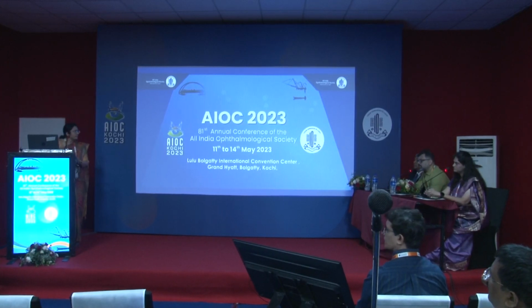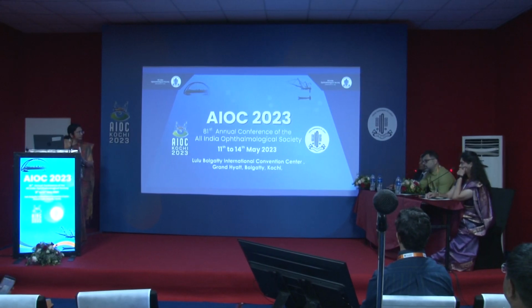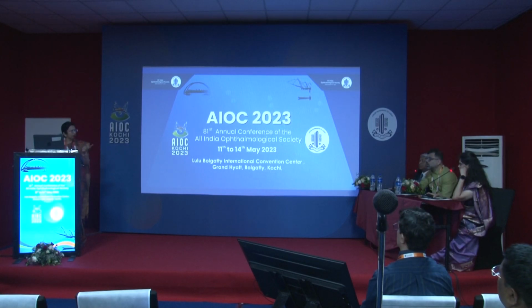Yeah, it's free. As per the latest literature which I read, I think Kane and Barrett 2 are more or less equivalent. Kane used to be better with keratoconic eyes, and now the Barrett TrueK is giving the same results as the Kane for keratoconus as well. Either is good. Barrett TrueK, I think, is for post-refractive eyes. No, now the latest one, he has got a Barrett calculator for keratoconus eyes also, separately. I use the Argus. In the Argus, if I press keratoconus as the pre-existing disease, it directly converts to Barrett, through Kane.